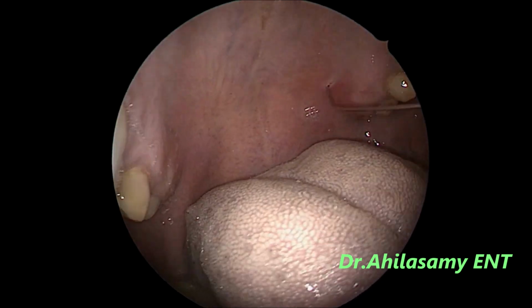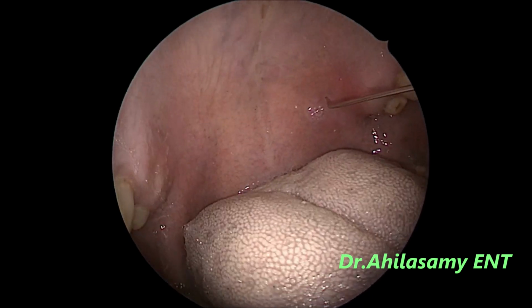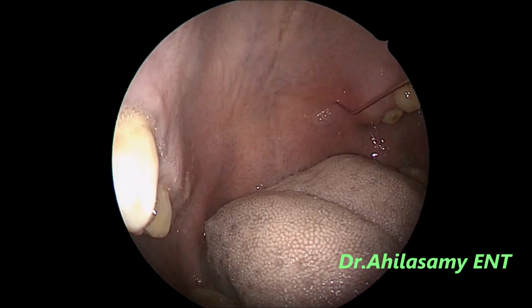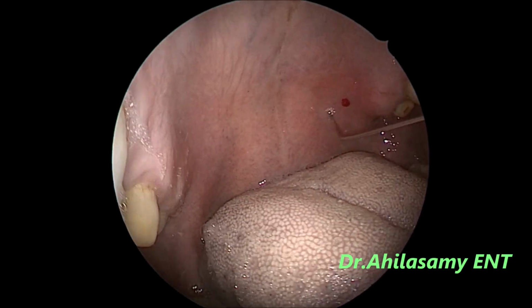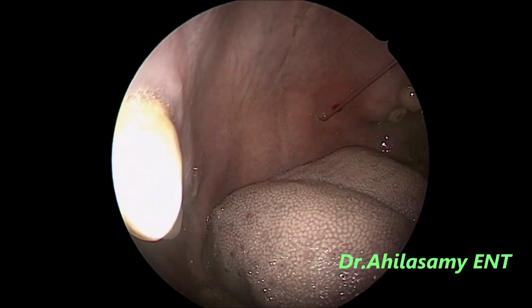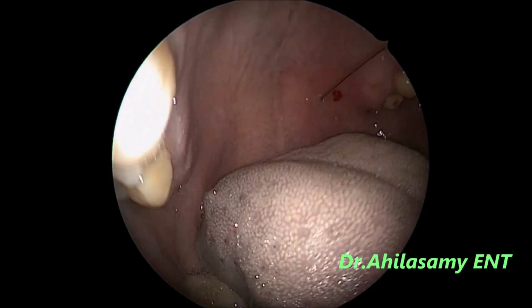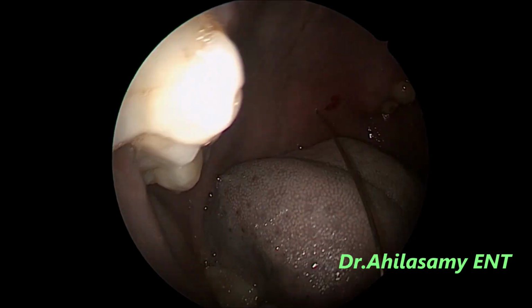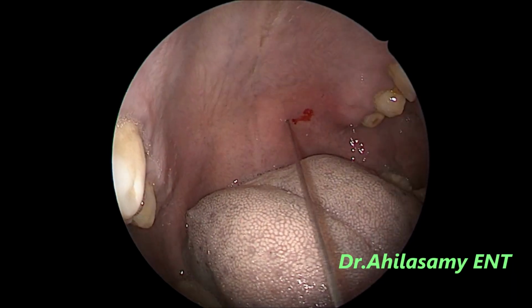The greater palatine foramen is the only foramen that can allow the needle. You may miss the needle, but you can get it by palpation and repeating. Now I have gone into the greater palatine foramen. I will be injecting around 1 to 2 ml of ropivacaine with adrenaline for good anesthesia.